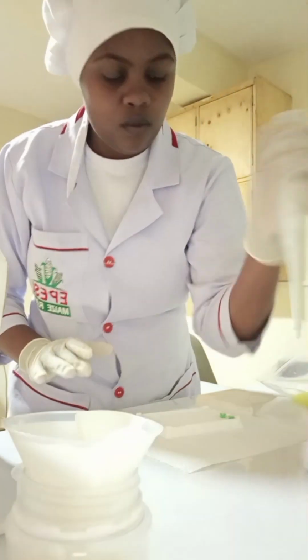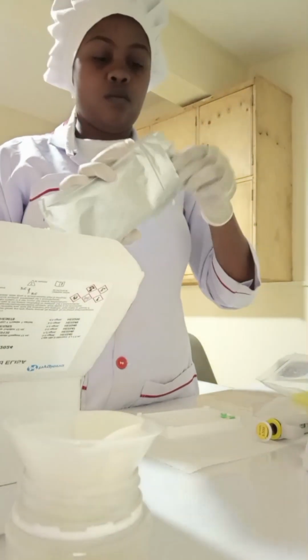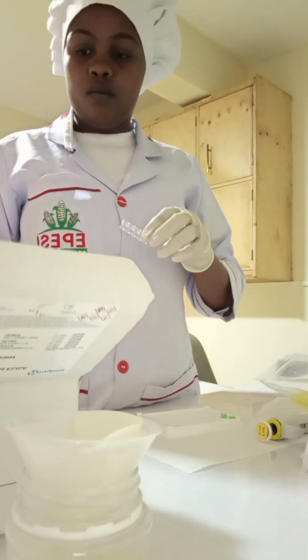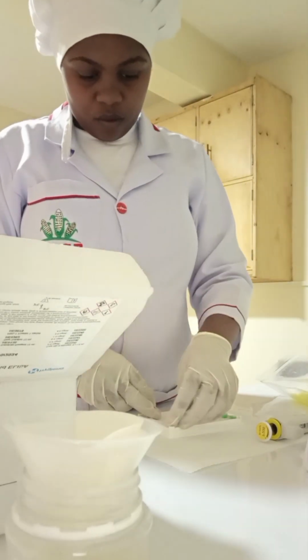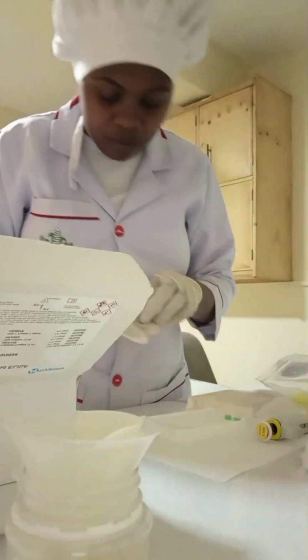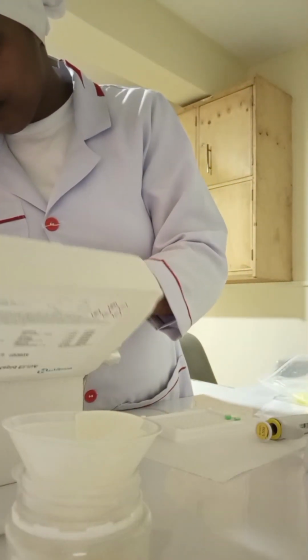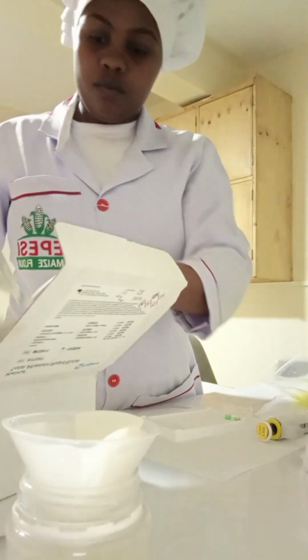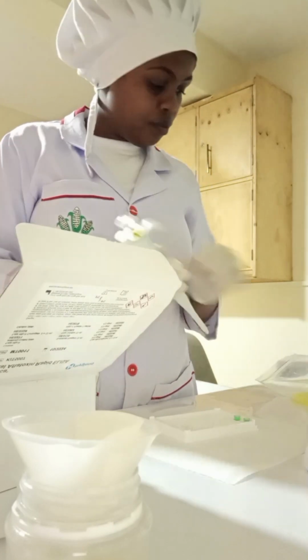After mixing, now you take the clear wells. Those are the clear coated wells. They are coated with aflatoxin antibodies. You take 2 of them very fast. And also remember, yeah, I was trying to see maybe kama imemweka juu nilishake, but it was okay.